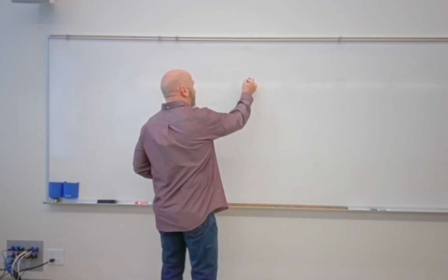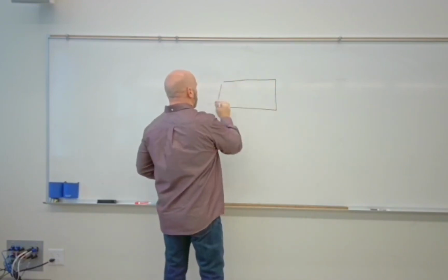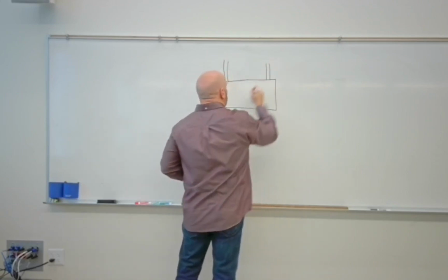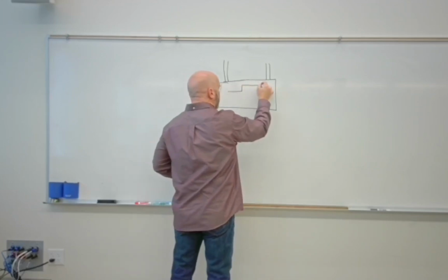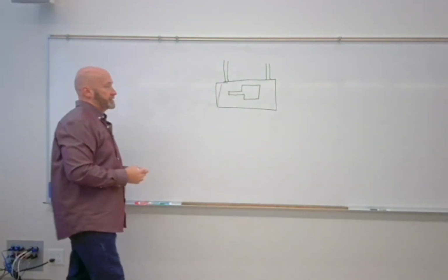So what we have then is protective housing, and inside the protective housing, you've got the X-ray tube. The protective housing is what you can visualize. It's got those big fat cables coming out of it. And what we have inside of that is not just the X-ray tube, but some other stuff as well.